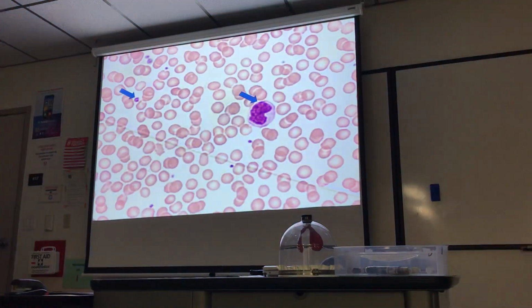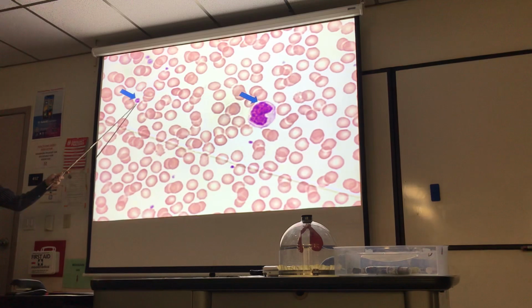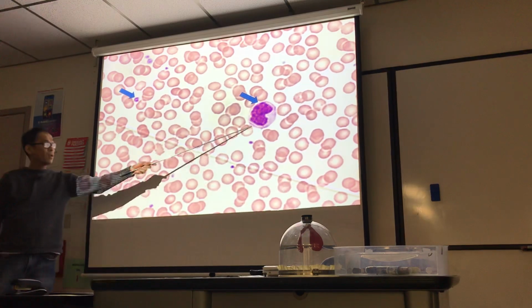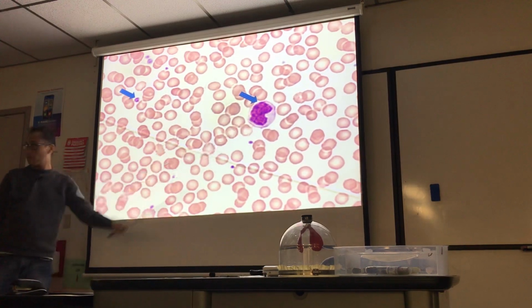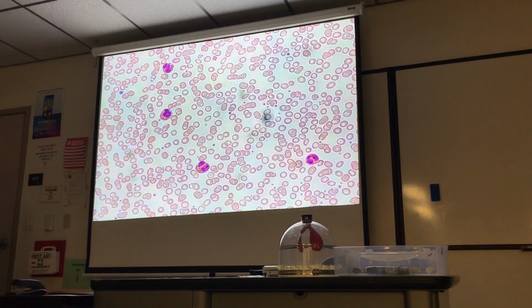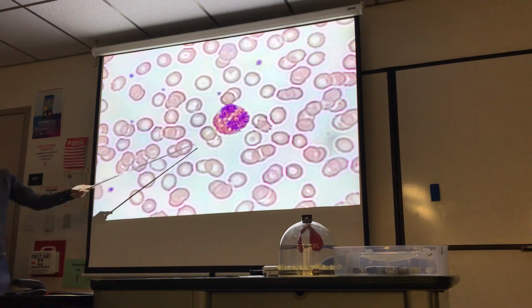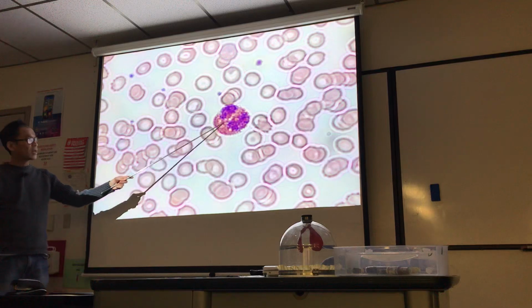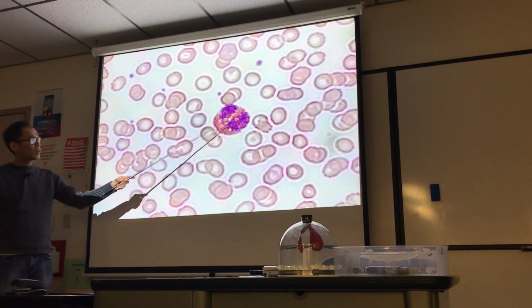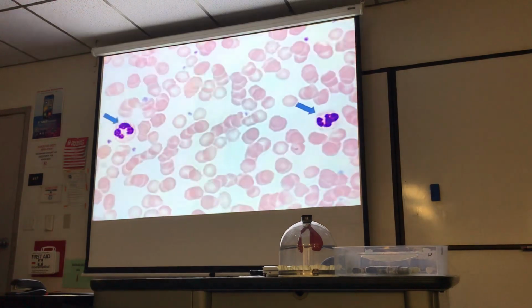Now we get into the blood. I have two arrows here. What does this point to? Fragments, platelets. That's a beautiful monocyte, kidney-shaped view. These are all eosinophils. Here's a better one. I like this one for eosinophil. It's a little blurry, but you can make out the red granules in the bilobed nucleus. Eosinophil. These two are the same, neutrophils.